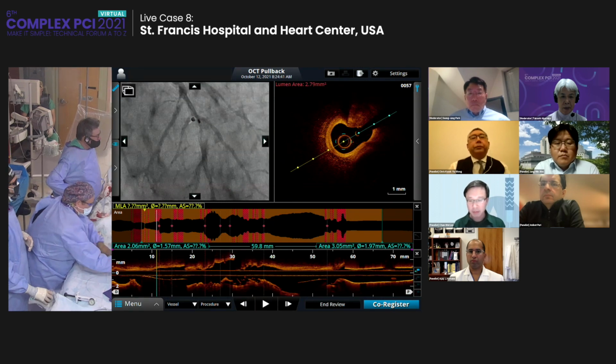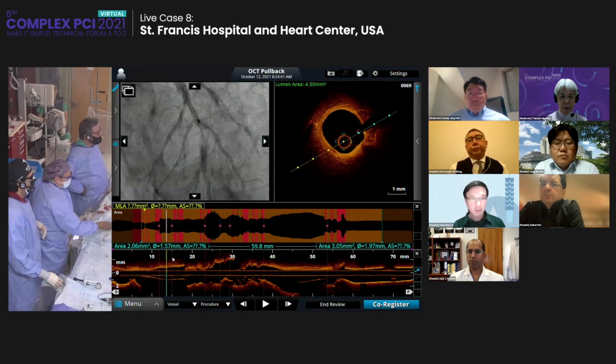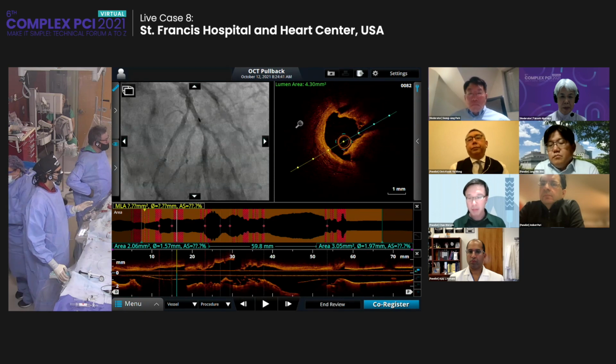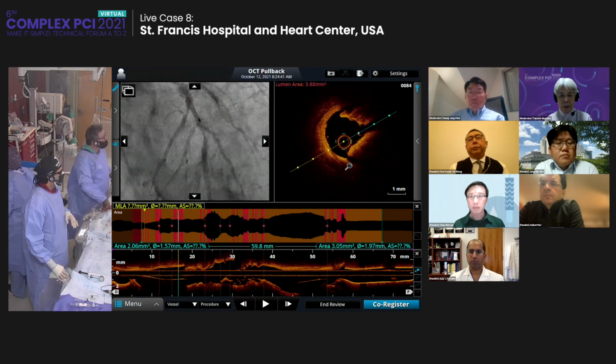So here you can see where we started, which was next to the branch. And now you can see that it's completely yielded. There's the fractures. Now this is really important, okay? Look where the fractures come. They happen next to the nodule, and this is actually a very common finding. You see some indentation, but the reason is the path of least resistance is actually next to the nodules on the 2 sides.